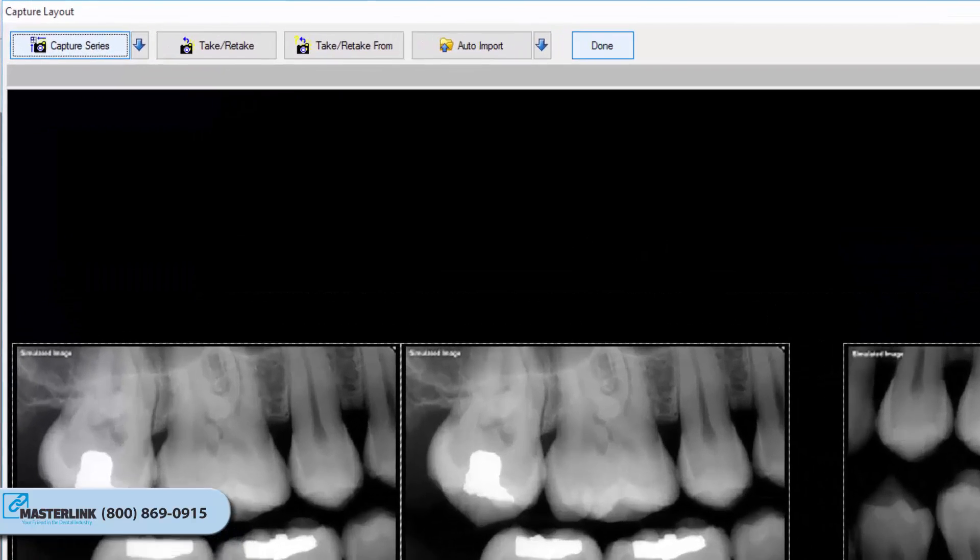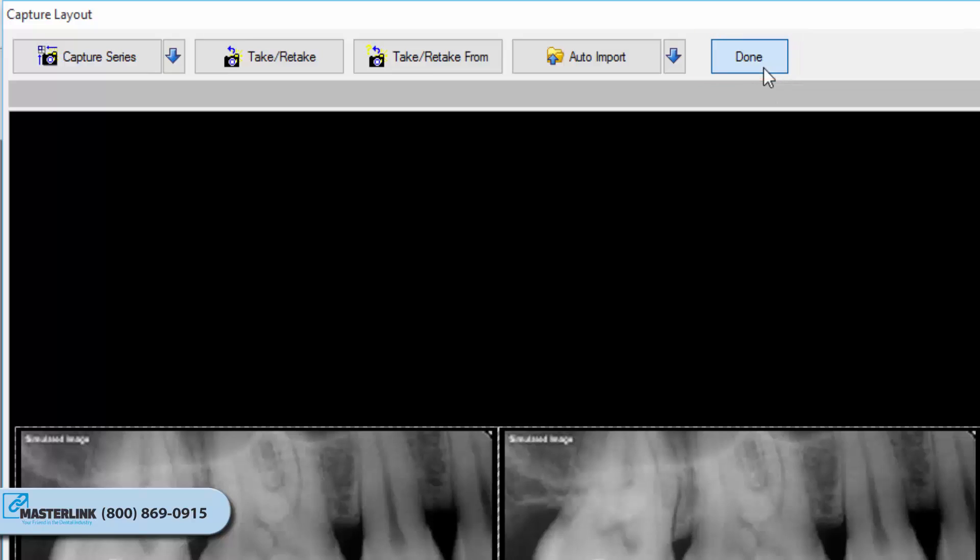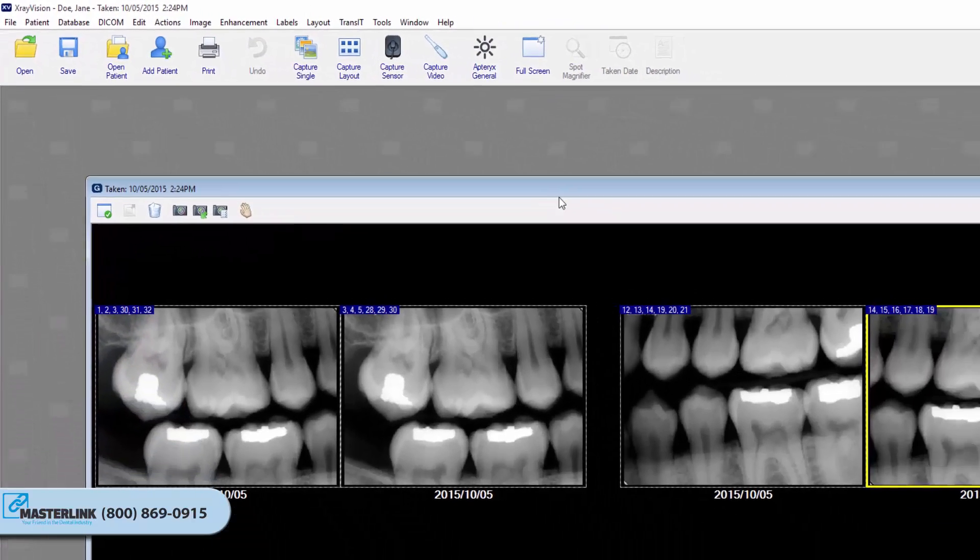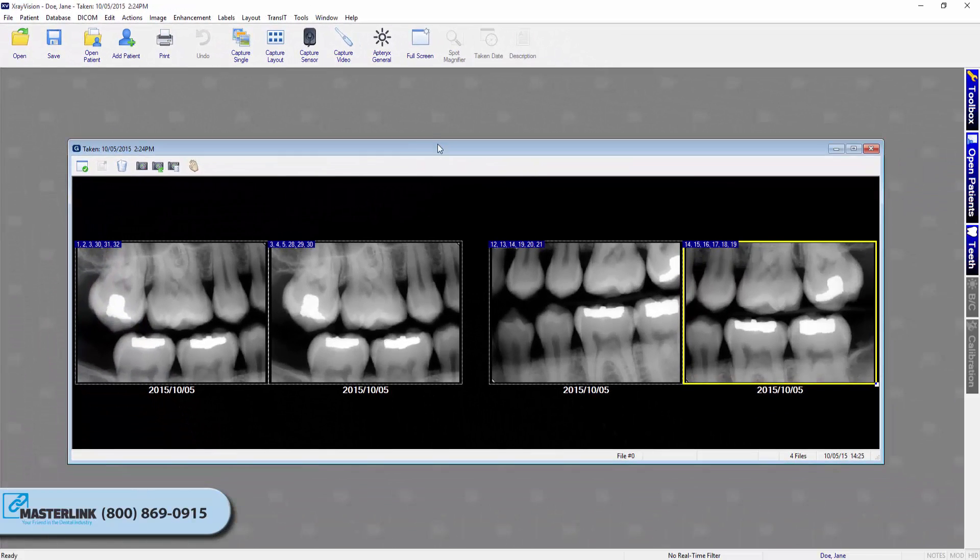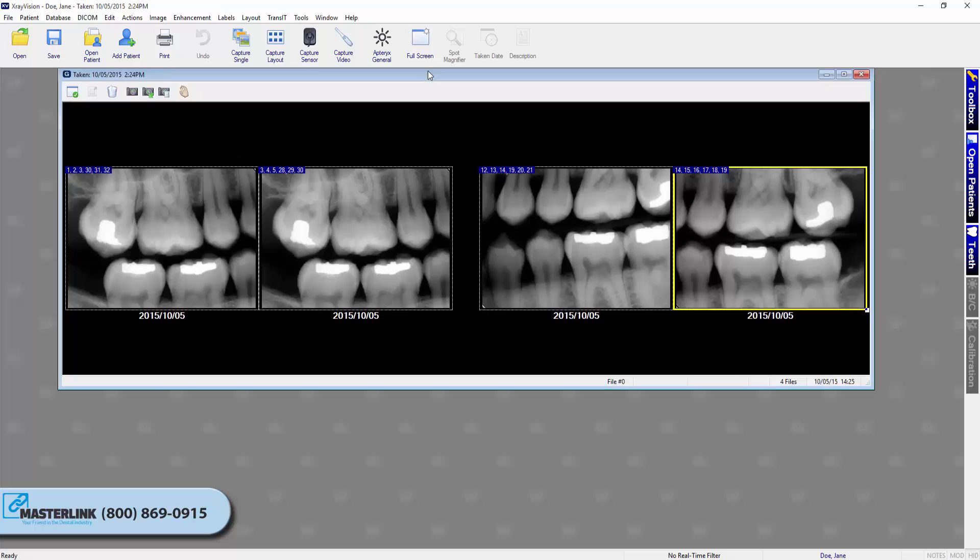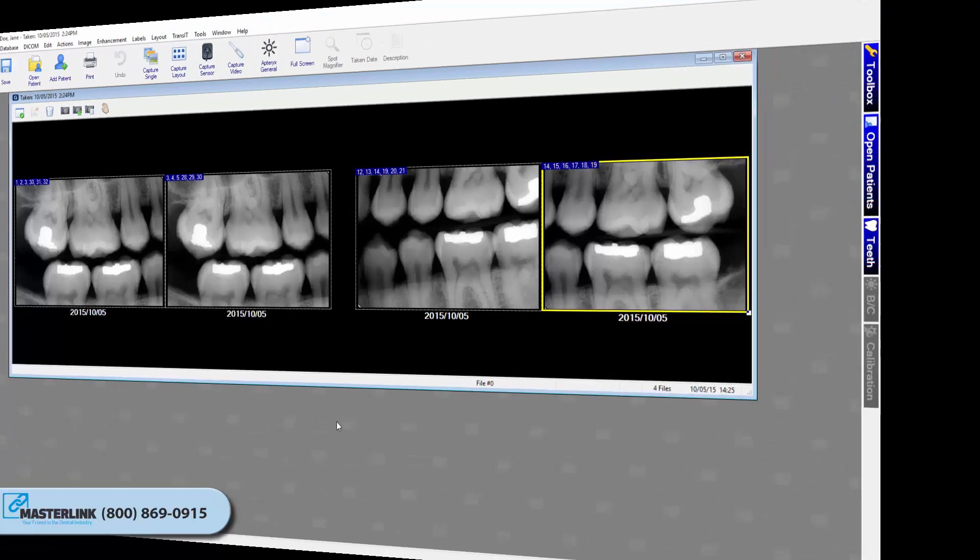Once all the images are captured, click the Done button. The Layout Capture screen will close and the layout, complete with images in each tile, will display the Layout View screen on the application's desktop. For more information about retaking images and other interactions during Capture, refer to our Interacting with Layouts video tutorial.